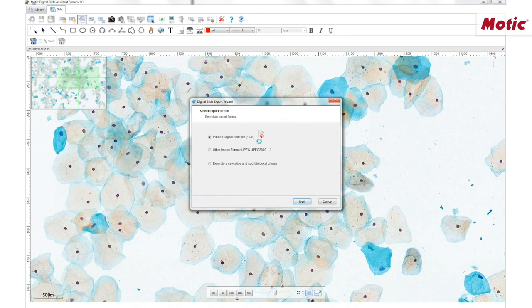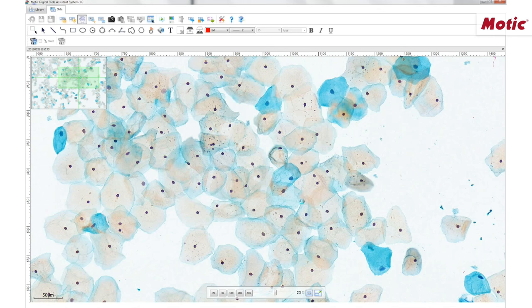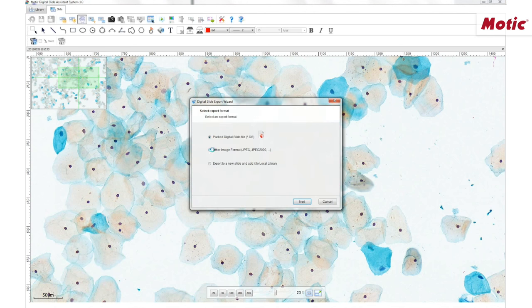This software allows the user to share the images as well as to export them in different formats. We can choose between exporting the whole image or just parts of it. As a first option, we can export the DS file, which means exporting the complete digital package — the interactive image plus any additional information like annotations, measures, or any edited files. The new file will be compatible with DS Assistant or DS Assistant Lite. The Lite version is available for free download from the Motic website. As a second option, we can export the image itself as a standard JPEG or TIFF file.